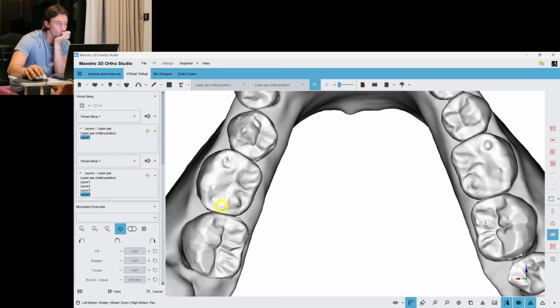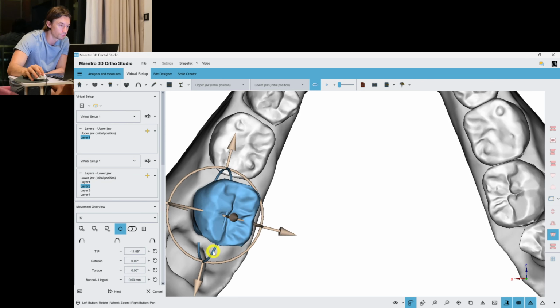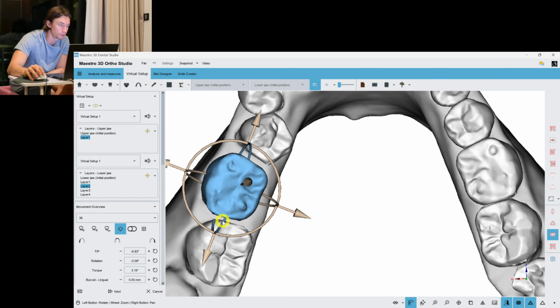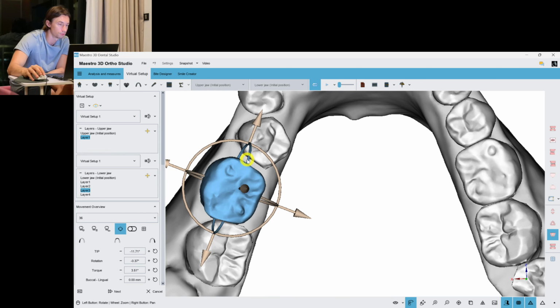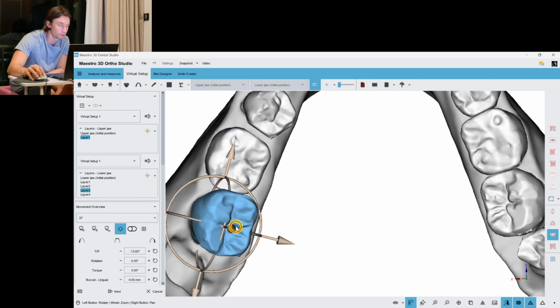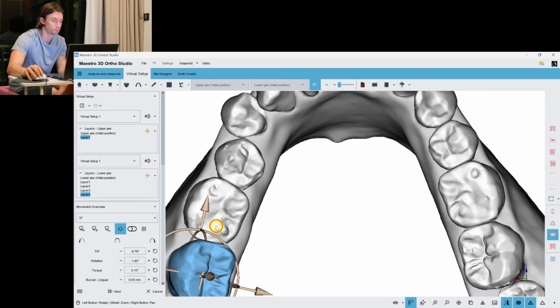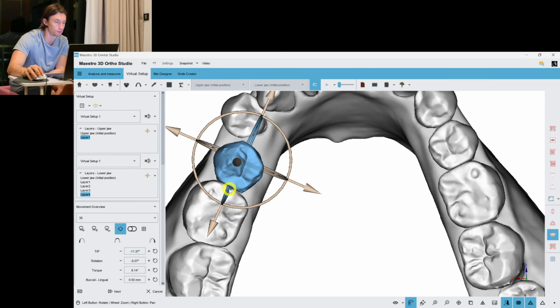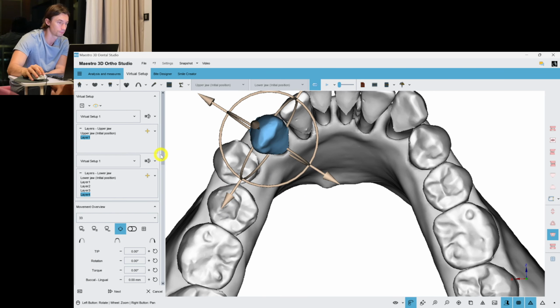I guess I should increase the amount of distalization. So let's get back to layer 1, make it -7, layer 2 -14 or 13, let it be. Here -7, layer 3, reset this tooth, move the first molar to the final position, like that. Layer 3, this one for -7, up, reset. This one here, and at the next layer this tooth will go here and this will go there. Okay, looks better.